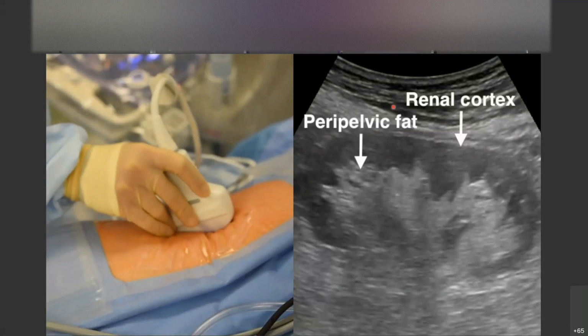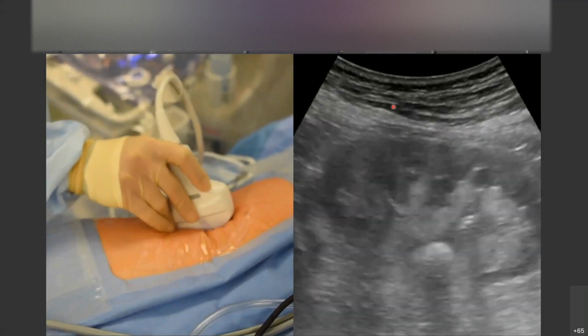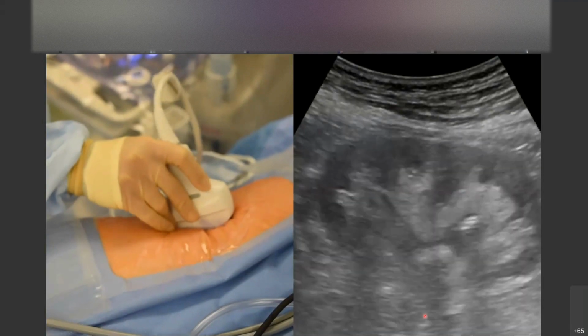We want to remember that our hydronephrosis is going to be inside of our peripelvic fat. You see our stone here again with the posterior acoustic shadowing.